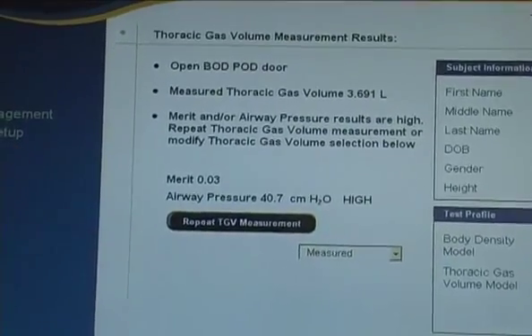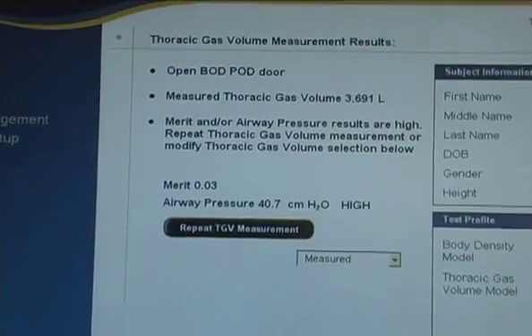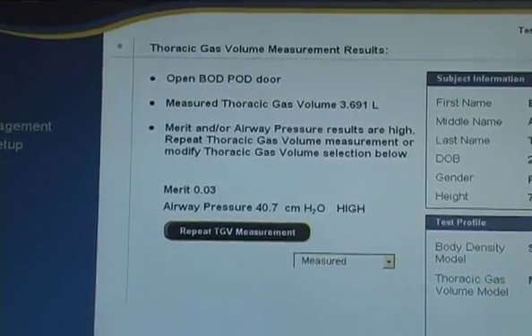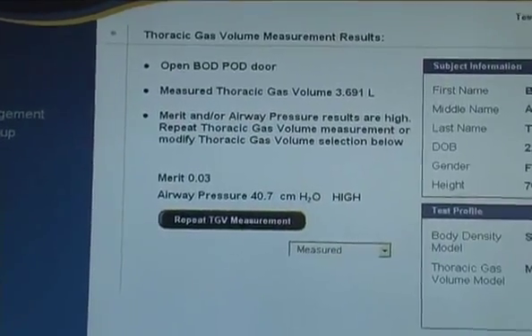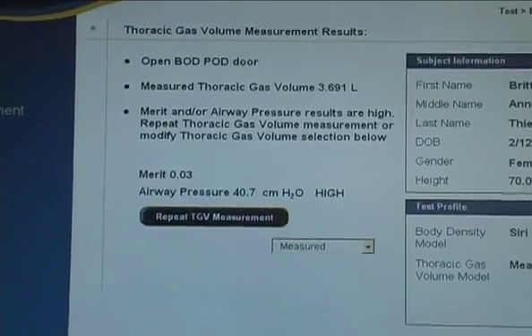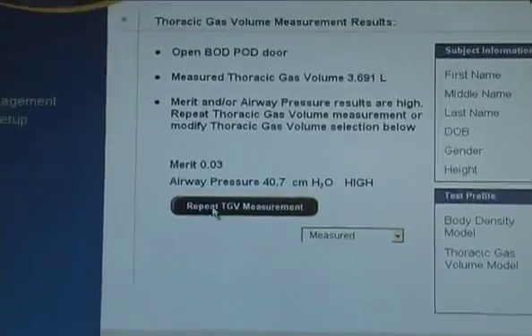Again, it's just practice for me. Pretend there's a feather on your hand. Huff 3 times. And it's perfect. It's just out, out, out. Real light. You can't huff too light. I can't stress that enough. So let's try it again. That tells you that you can essentially repeat the TGV.